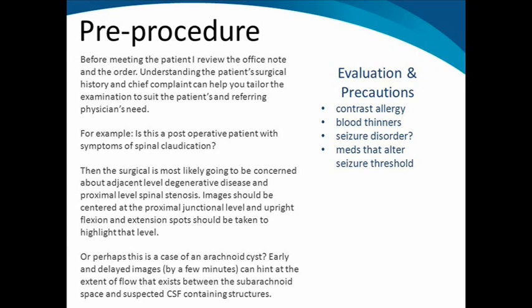Make sure they're not on any blood thinners, including aspirin. Make sure they're not on an anti-epileptic. If they have a seizure disorder, they have to continue that medicine up until the point of the myelogram. Oftentimes patients hold all their medicines prior to a procedure, inadvertently holding their anti-epileptics, and this can alter their seizure threshold. We would not perform a myelogram in that case.